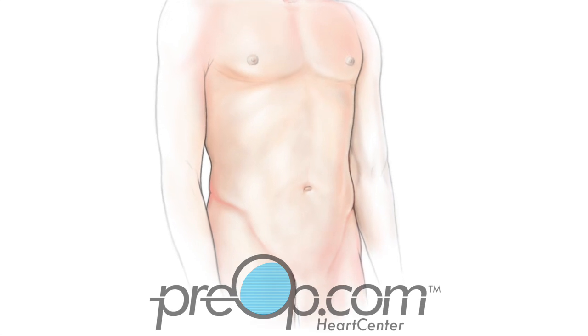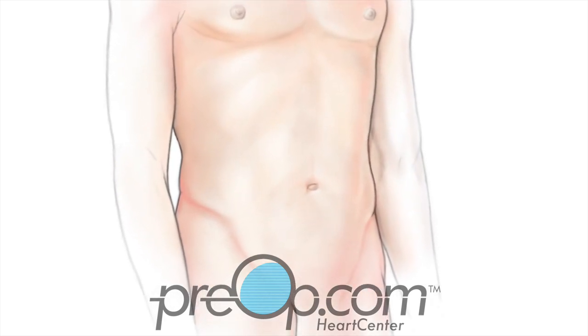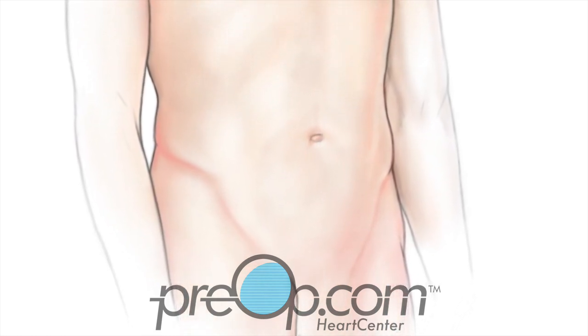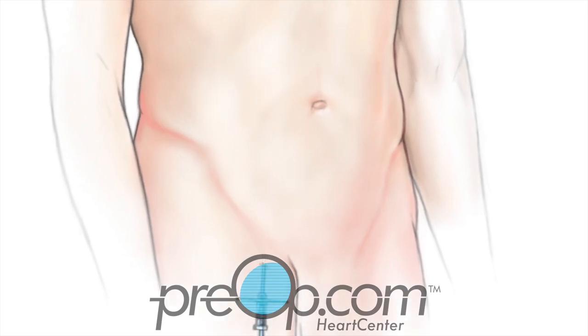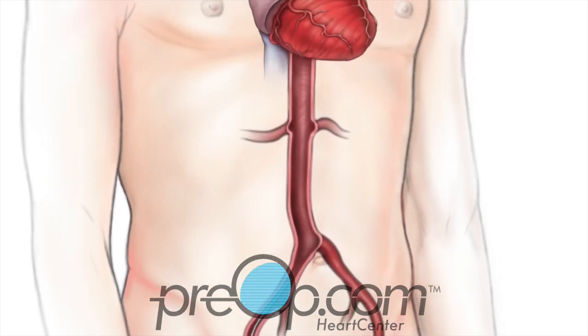For your cardiac catheterization procedure, you will be positioned carefully on an X-ray table. The skin over an artery of your leg or arm is cleaned, then numbed with local anesthetic. You will feel a sting and burn that lasts only a few seconds. A tiny cut is made over the artery and a guide for the catheter is placed. You may feel pressure, but you should not feel pain.